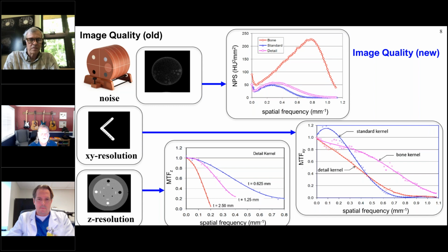The XY refers to the axial plane on a whole body CT system. You can see the dependency of the various kernels that are used in whole body CT on these plots. Again, it's a quantitative measure of spatial resolution that would be very useful to measure annually, so you can see if something's changed, if the focal spot has degraded and your resolution has degraded. You're never going to pick that up on a bar phantom.